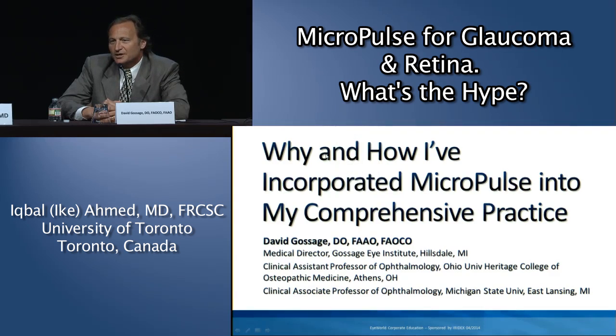So the main thing I have to say is give it faith. Even though you're not seeing a tissue reaction, you just have to make the assumption that it's working. You'll see a greater effect, I think, at 3 to 4 months than you will at 1 month. So I wouldn't opt to retreat right away. I'd watch these patients. But the effects at 1,000 milliwatts seem to be so far longer lasting.